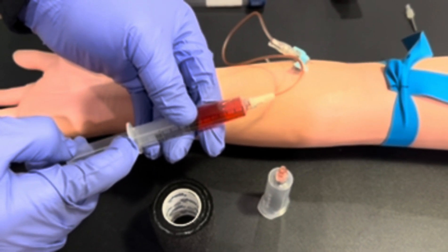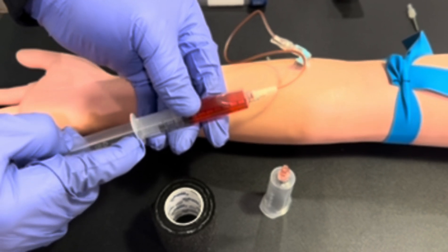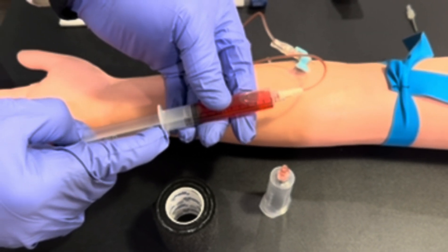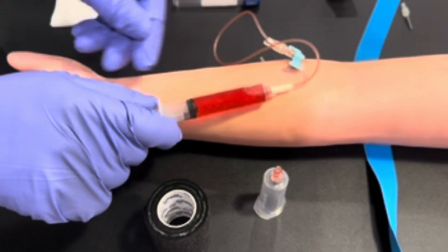Slowly pull back on the plunger and allow blood to fill into the syringe. After blood has filled up inside the syringe, release your tourniquet.